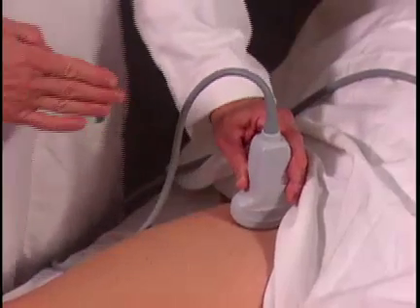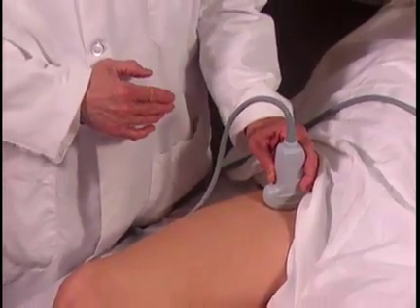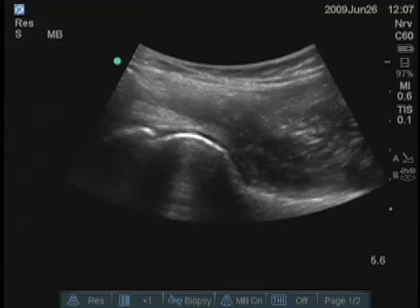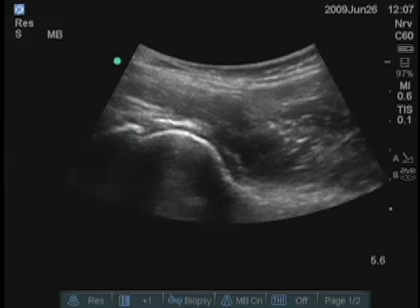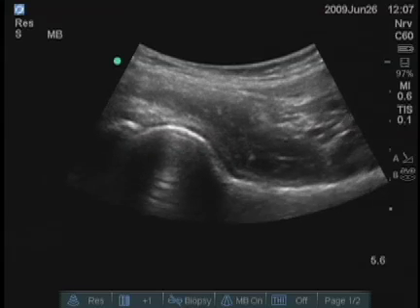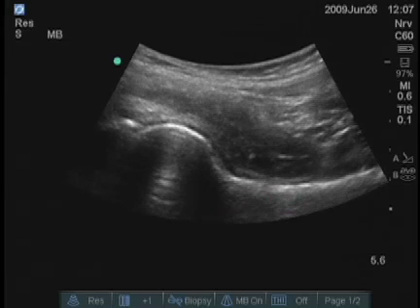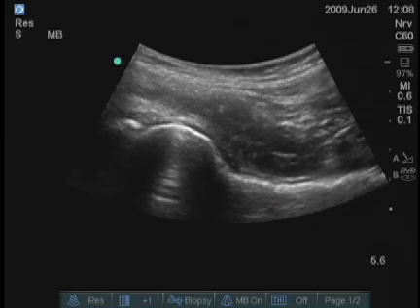I'm trying to align the transducer approximately parallel with the femoral neck. The left side of the screen — the hyperechoic line — is the acetabulum. The curved structure or circular structure is the femoral head. It then drops down to the femoral neck, and we can see the femur itself extending parallel to the top part of the image out toward the right.